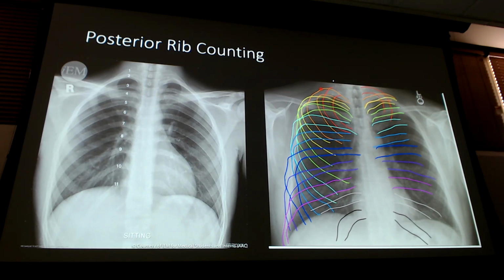I might just say, name this rib. Anterior, posterior, what number, right? So practice through that, get an understanding of the best way. If you're still confused on that, please let me know. I will help you count them. I will help you learn how to see them because I know how confusing that can get.